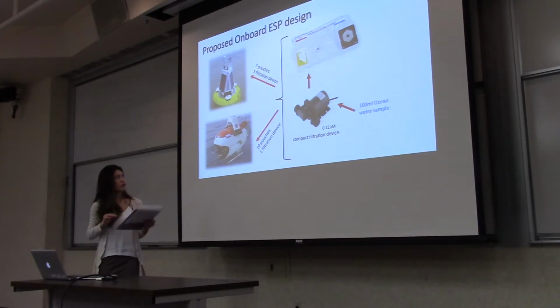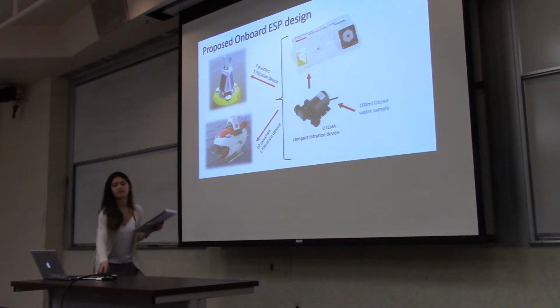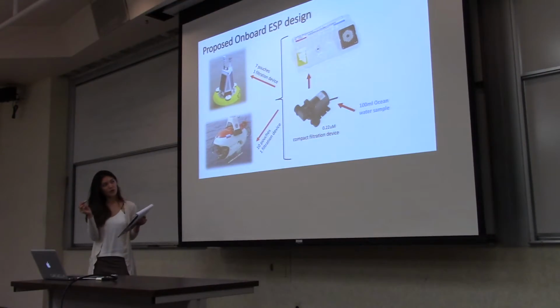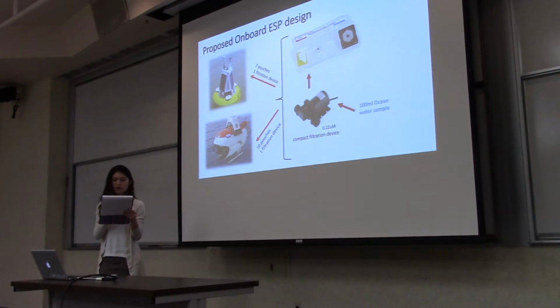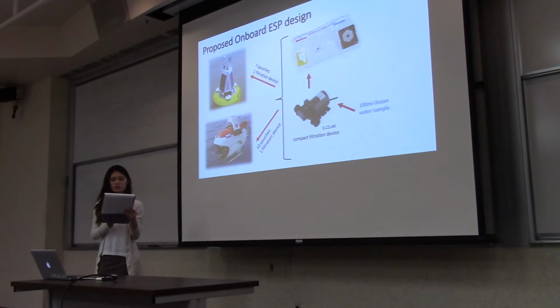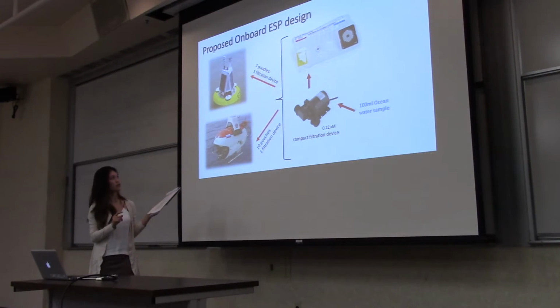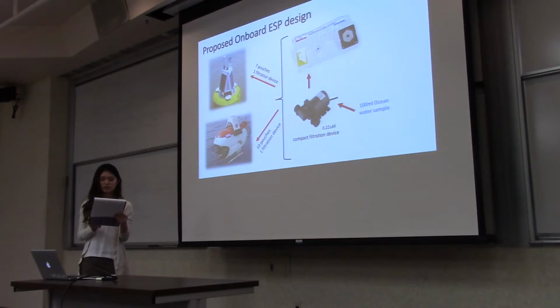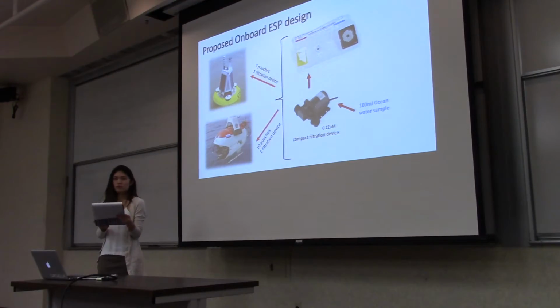So each device will include 2 modules, an auto-sampler PCR FilmArray bag, and a filtration device with a 0.22 micrometer filter. It would also include a water sampler. I propose to have 1 mobile ESP per 5 station ESPs at each location. The mobile one will take samples from different areas of the location to test for high activity, to find where you can place the buoy type ESPs. And the station ESP, the buoy one, is for more refined testing.